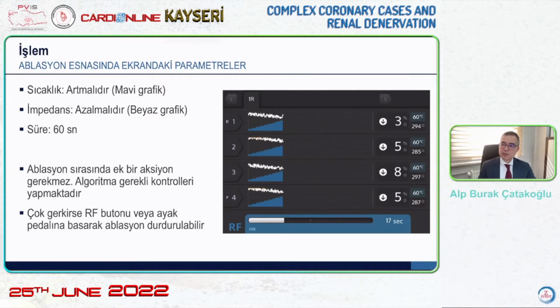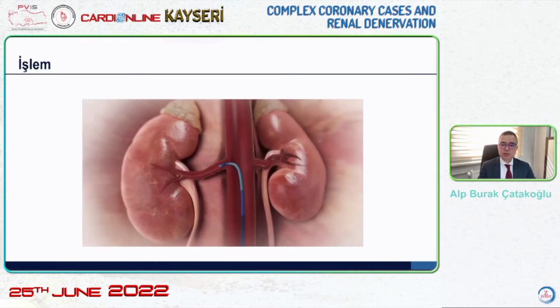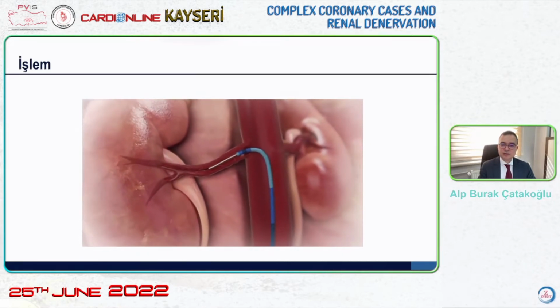If there's an anomaly, if there's an abnormality, the device shuts itself down. If you manually want to intervene, you can stop the ablation using the blue button or the foot pedal.